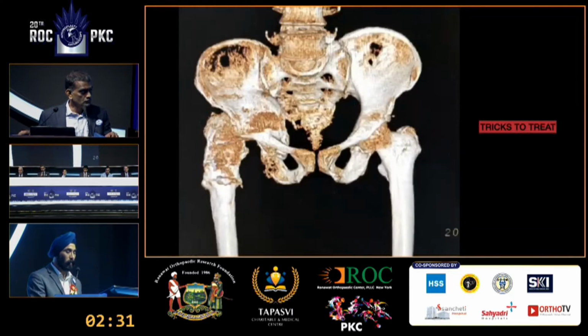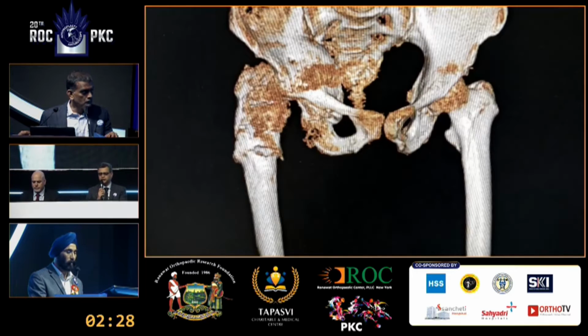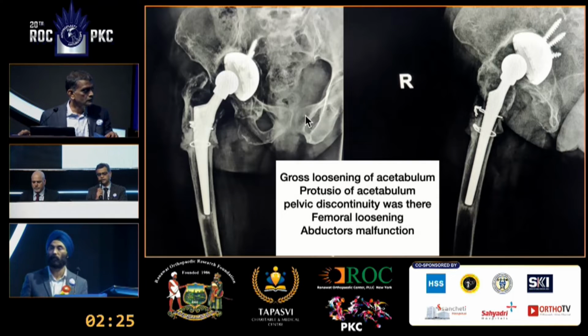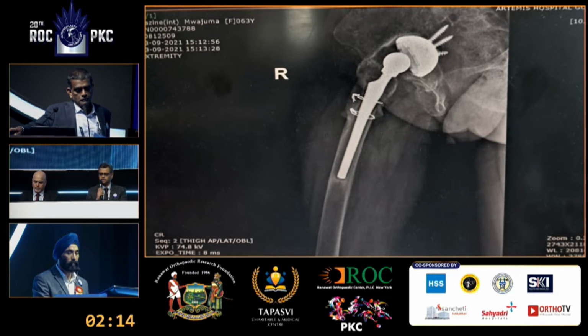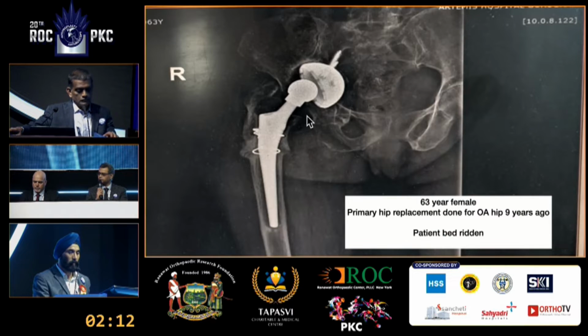Thinking from the acetabular side, I think that shell of bone on the medial side is a bit reassuring, and I think probably classify it as 3B without discontinuity. Either if you have access to bone grafting into that defect, or an augment followed by advanced ingrowth option cup, bring the hip center of rotation down. On the stem side, obviously an ETO probably just to improve your exposure, as well as take out the cup and the stem will make life much easier. We need to see, the bone looks patulous, but I still think that we will be able to get away with a tapered fluted titanium stem.